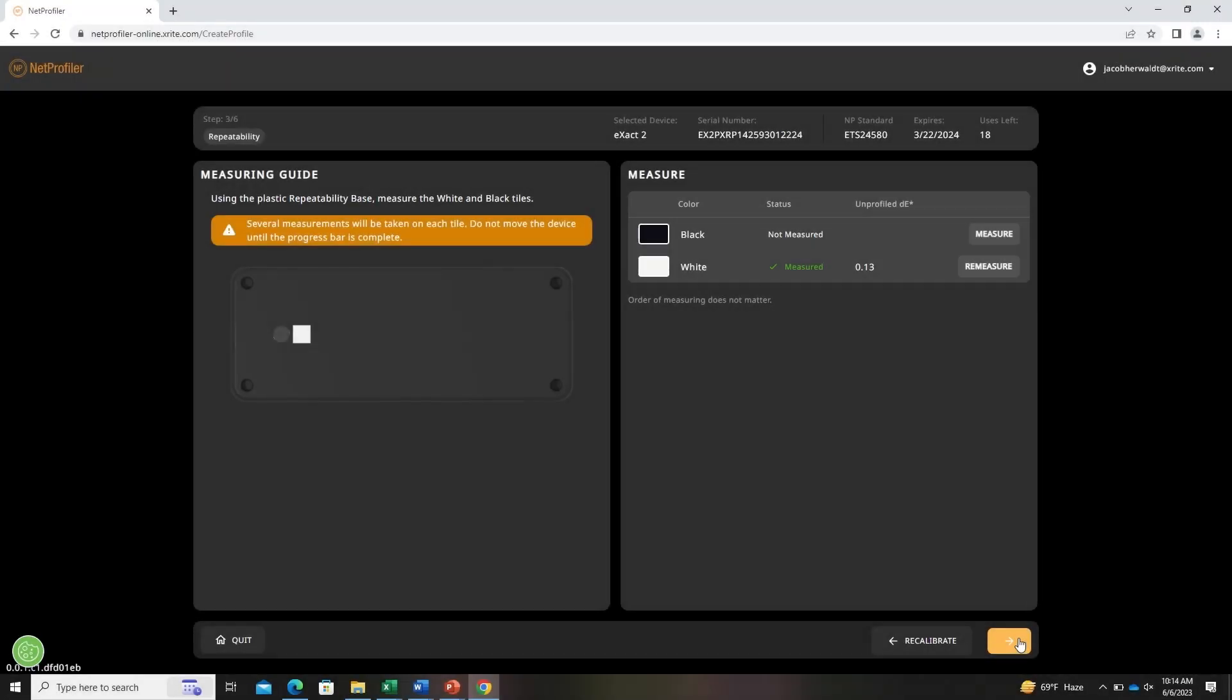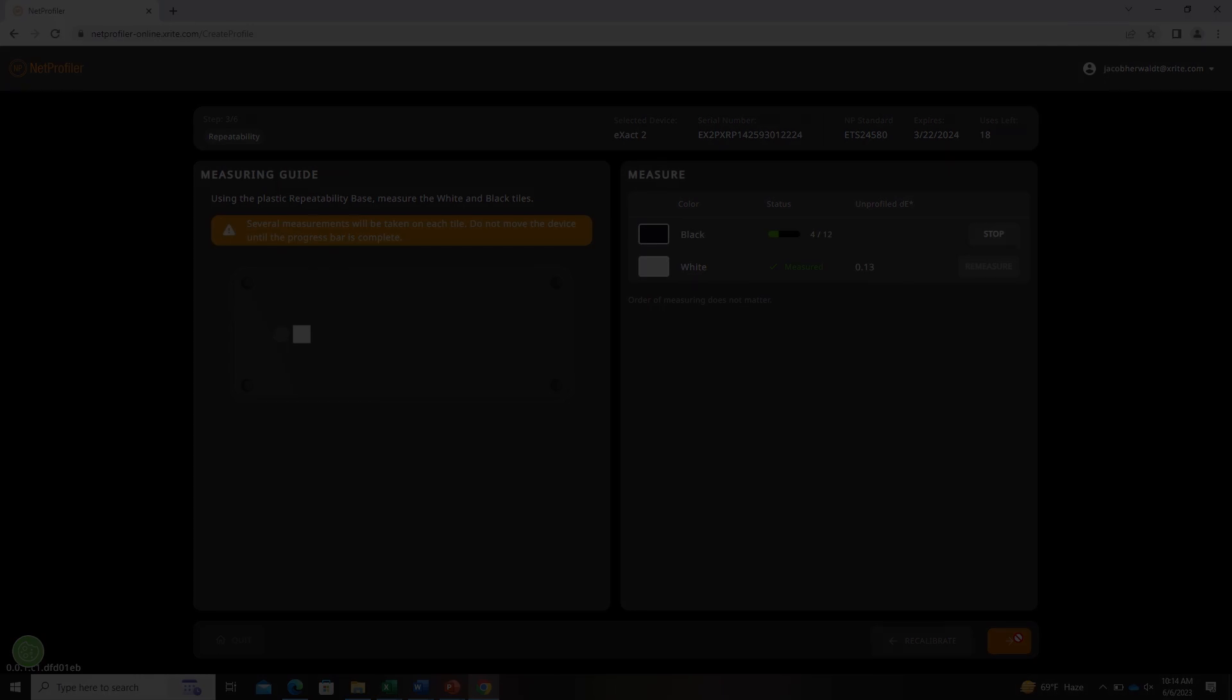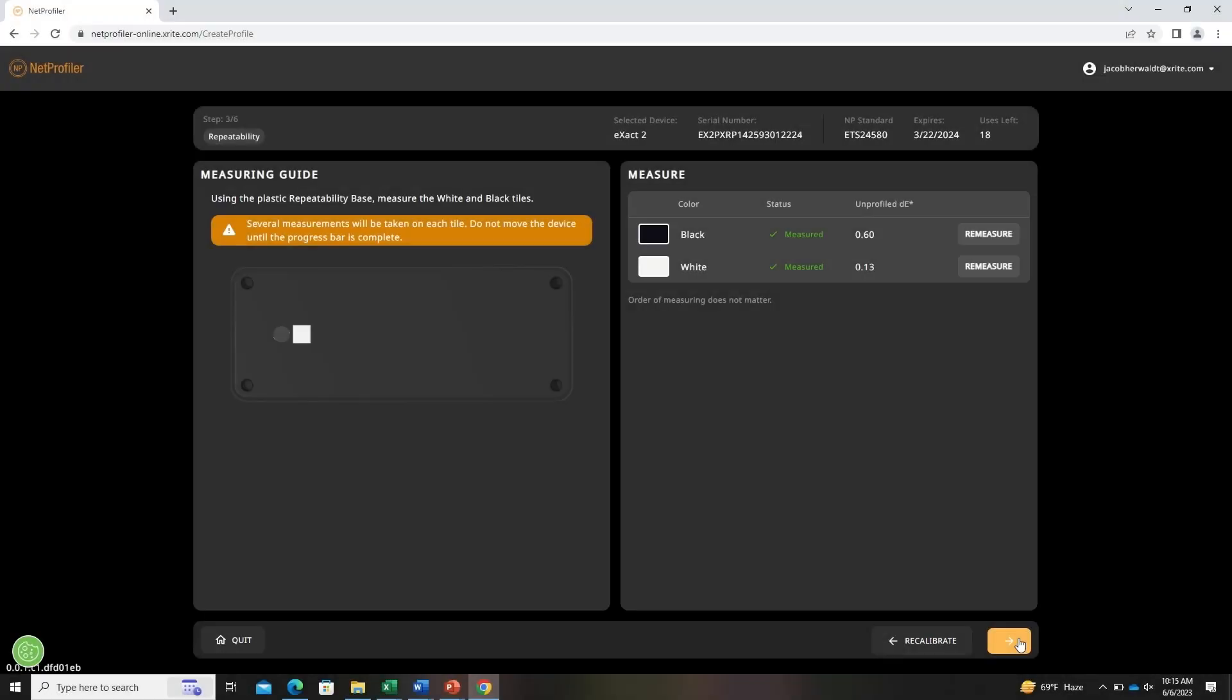Now move the device to the black tile and repeat the process. Okay, now that that is completed, we can go ahead to the next step where we'll calibrate the device again.